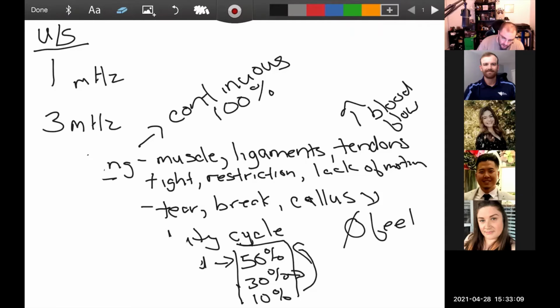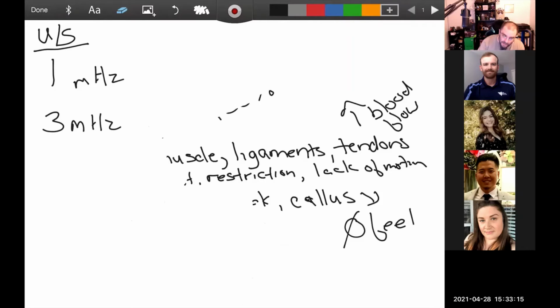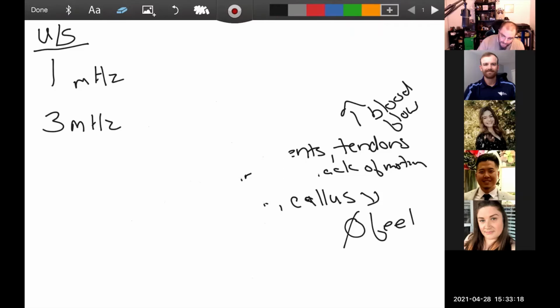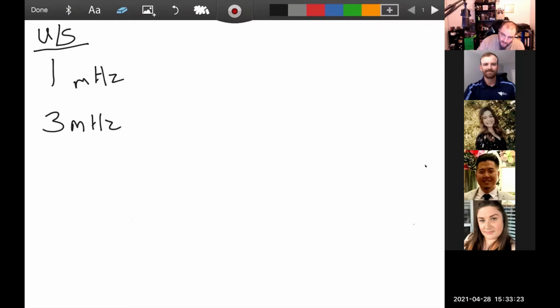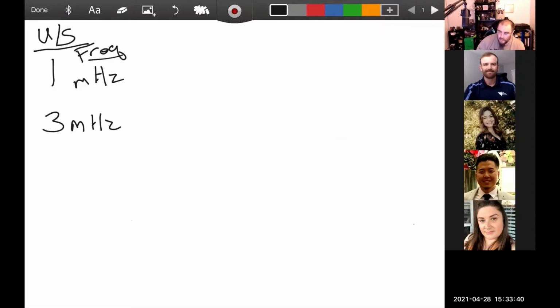So now once I've determined if I'm doing heating or healing, the next thing I have to determine is the thing that you guys were all just trying to use there. What was the next thing? How deep I need to go. Depth of penetration. Yeah, depth of penetration. How deep do I need to go? That's when we get into this, which is the frequency, right? This is our frequency. And again, 3.3. I'll put 3.3 down here, and we'll talk about why 3.3 is a little different than 3.